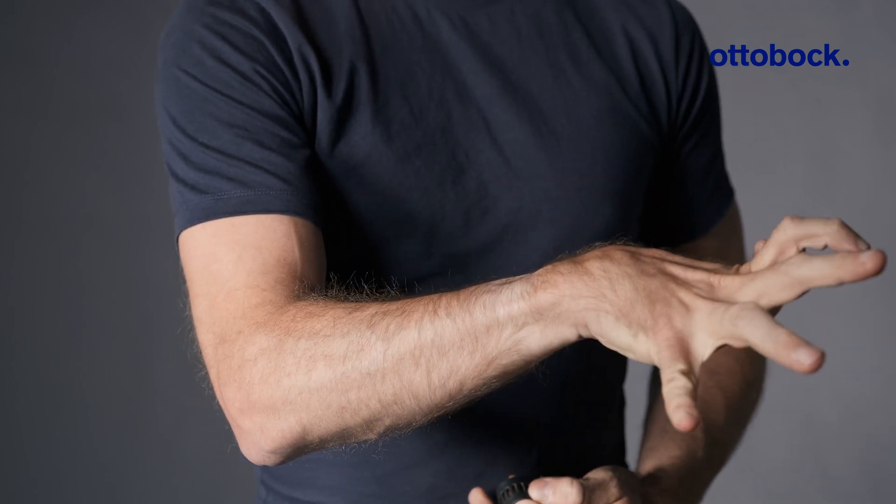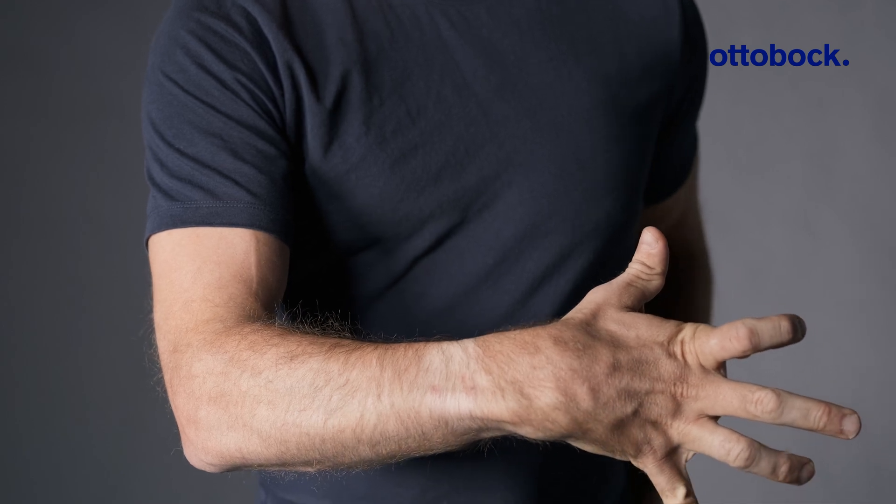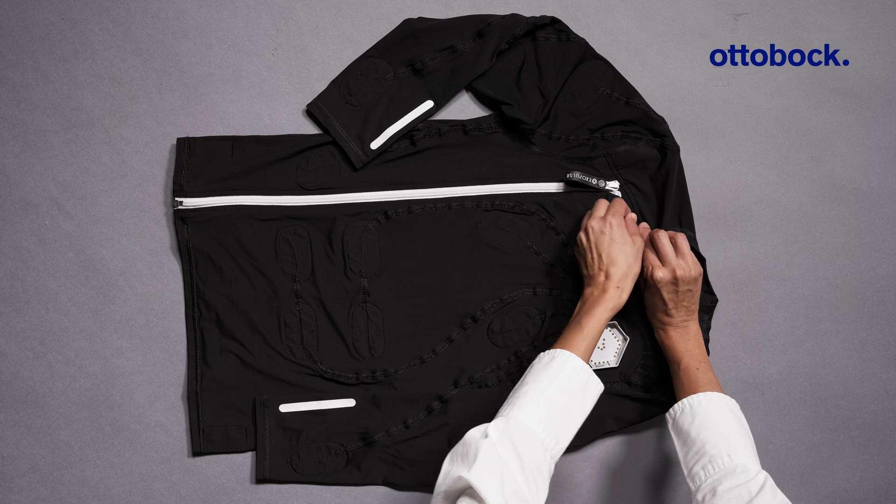However, avoid applying lotion or other skincare products right before the session. Before putting on the suit, open all zippers.